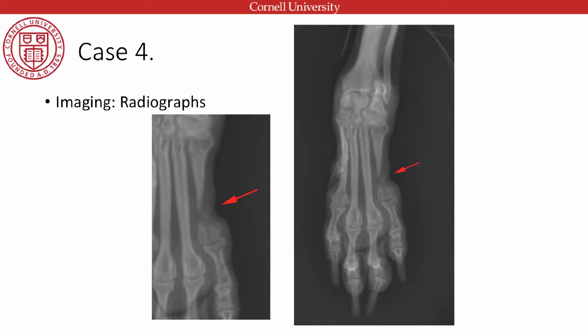I think that's hard for you guys, because that was something I was considering when looking at these radiographs. How can I give an accurate timeline on this? Because that's actually really helpful for you in the clinical case scenario, but also in a legal sense, knowing how long ago this happened in relation to all these other events. So that was something I was trying to tussle with, and unfortunately we don't have any studies that say, okay, how quickly does bone demineralization occur secondary to this specific injury? So it was something I was trying to do when I was creating these lectures, but it seemed to be quite challenging.